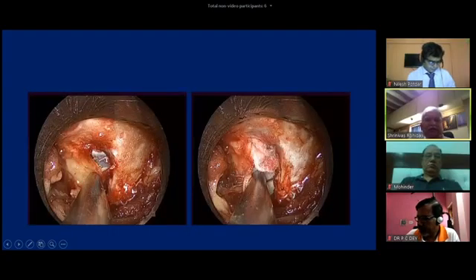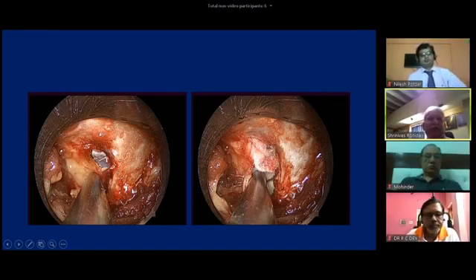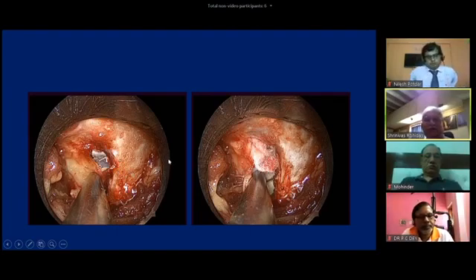Now this is on the right side. This is cranial, caudal, medial and lateral. Now in an endoscopic view, the up is always midline, down is always lateral. We have to decide about the right and left. If this is right sided, so the right is cranial, this is caudal. So this is the interlaminar window.